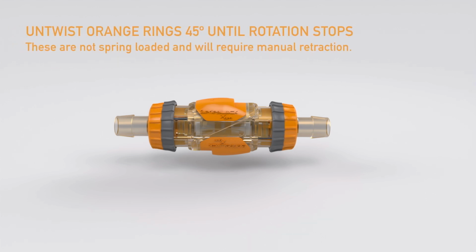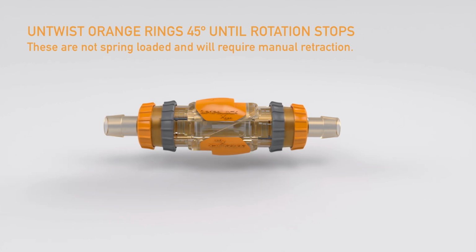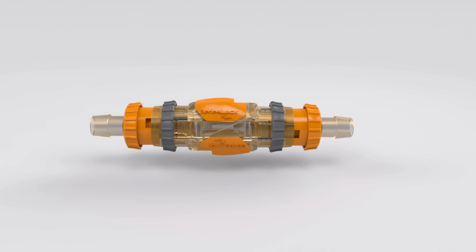Untwist the orange rings with a 45-degree rotation until rotation stops to unlock them. If rotating both rings at the same time, each hand twists in opposite directions. These are not spring-loaded and will require a gentle pull outward towards the tubing to return them to their original position. There will be some tension as the vacuum seal is released.